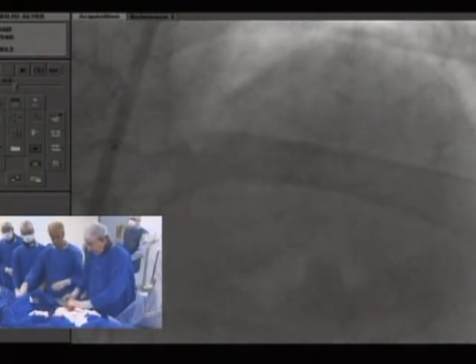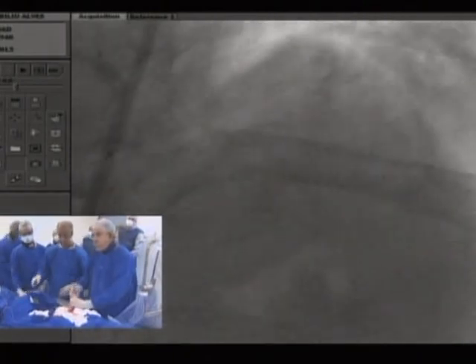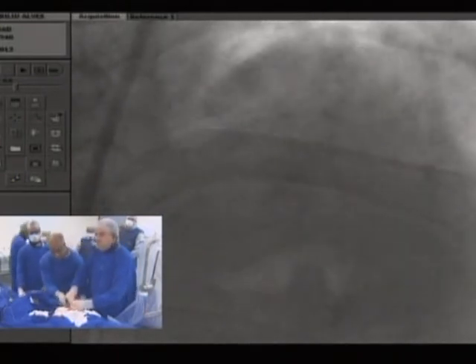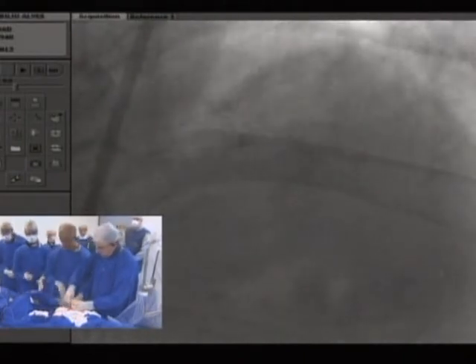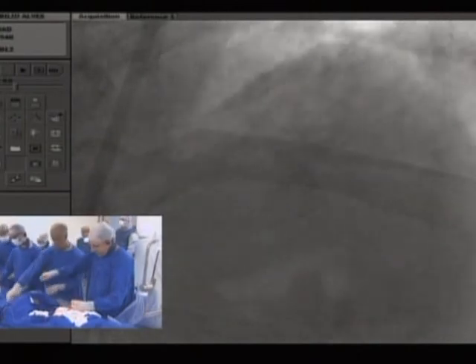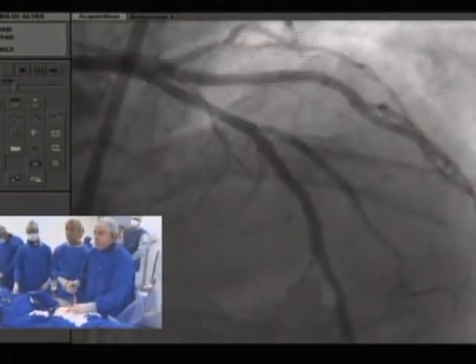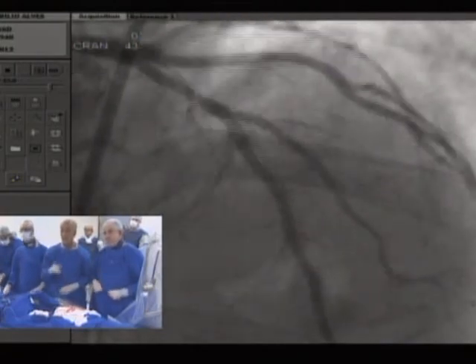So now he crushed the diagonal against the LAD. Okay. And now I have to say that at this point, kissing is a must. Kissing is always a must. Mainly after crush, I mean, bifurcations. Let's take a picture now. See, he pinched a little bit. Now you need it.